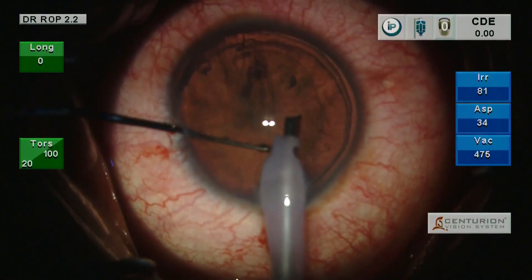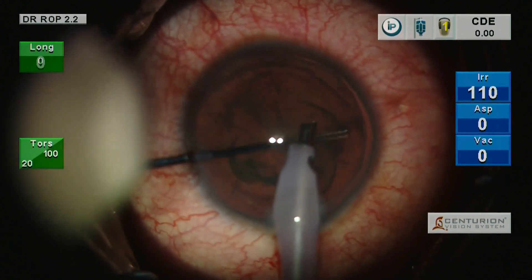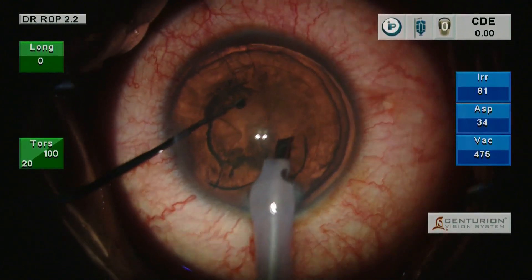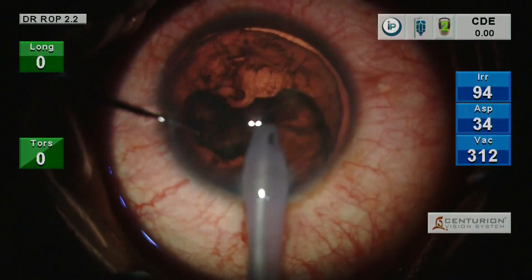This is another case of soft cataract in a young adult. The nucleus is rotated freely in the capsular bag from the side port incision by a chopper. Sideways tip alignment, rim placement, nuclear impaling, and devouring is performed. Thank you.